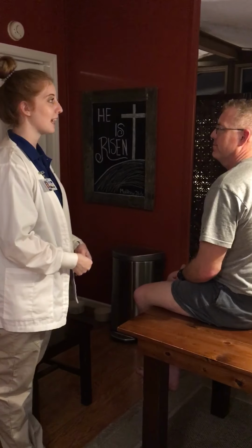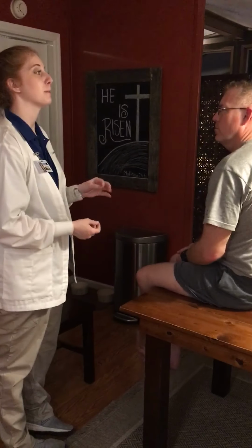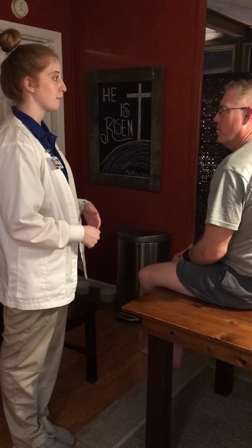I'm going to be your nurse for today. I'm just going to be giving you an injection intramuscularly. I'm going to provide privacy. Can I get your name and date of birth?